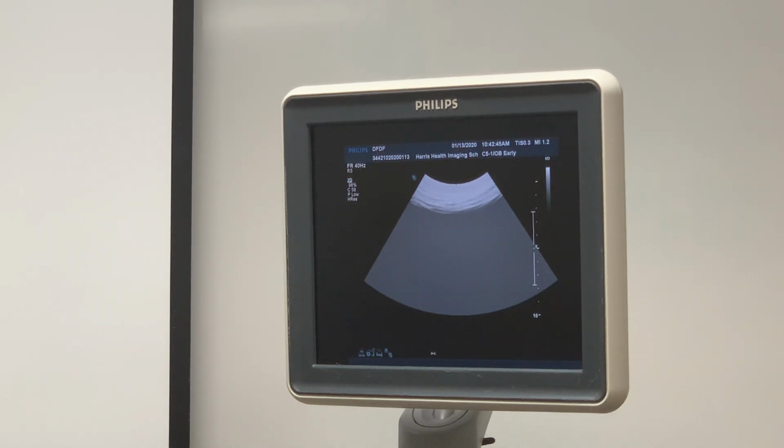But if I just need a static picture, like we only take static pictures. I don't think you guys take any moving pictures. Only time I take a moving picture is when I'm doing a fetus and I'm trying to show the fetal heart. Other than that, I'm not taking a moving picture. So our temporal resolution, honestly, we don't care about it too much. Ultrasound real-time imaging is already moving fast enough anyway that it looks like a movie.